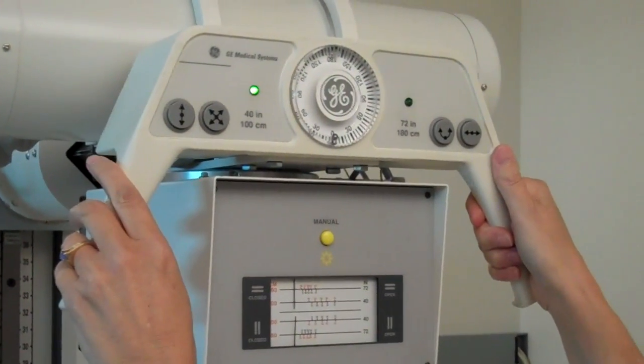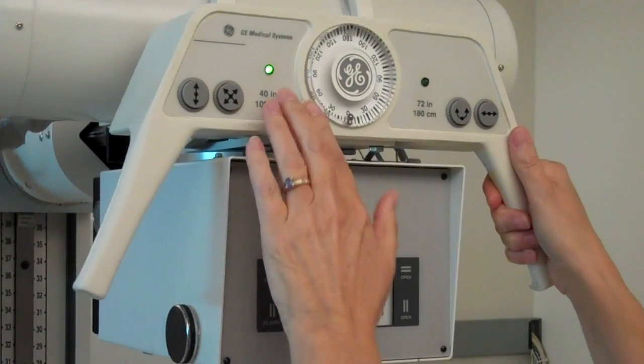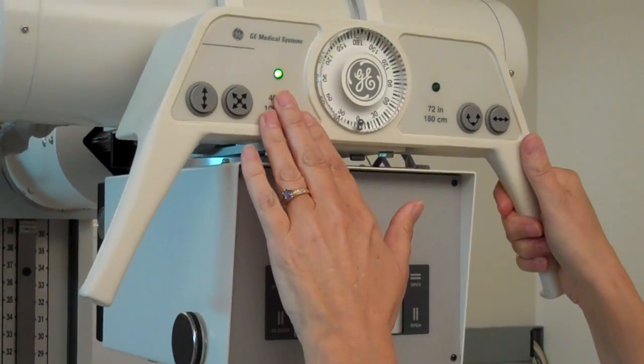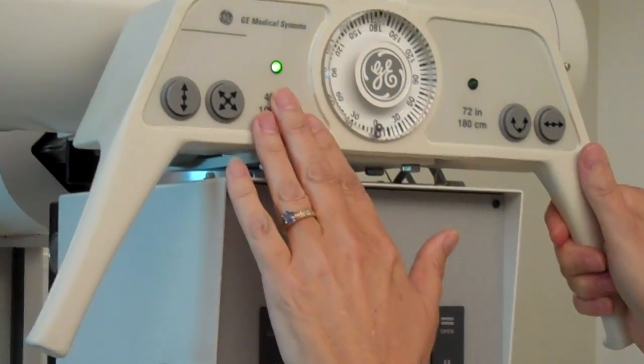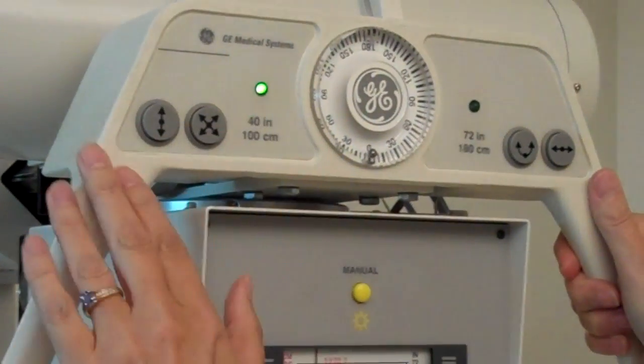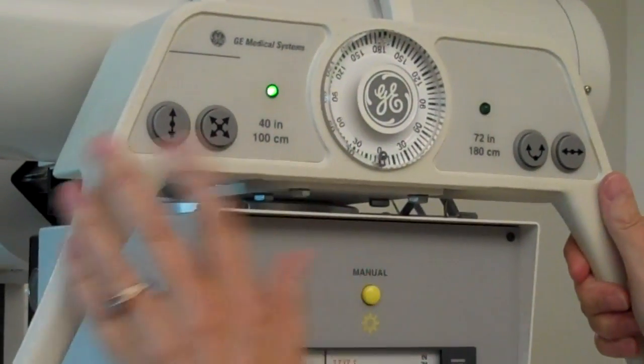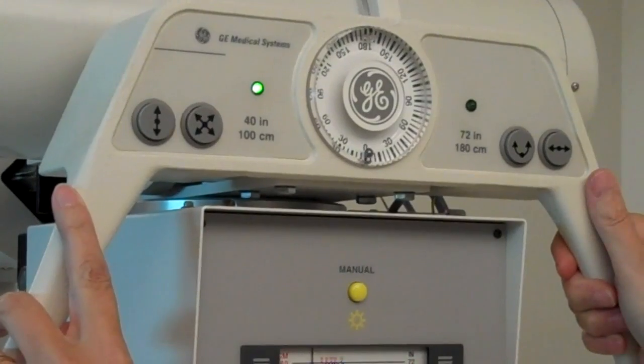If we're doing something in the table bucky, the light comes on at 40 inches to assure a 40 inch SID.